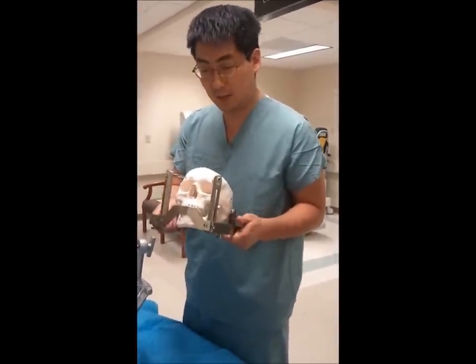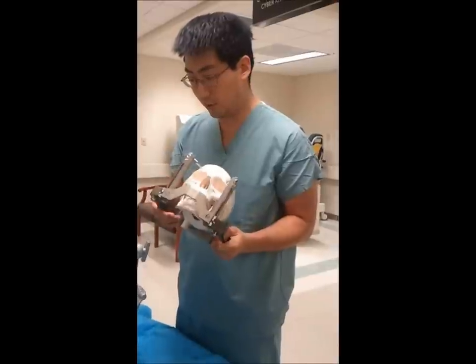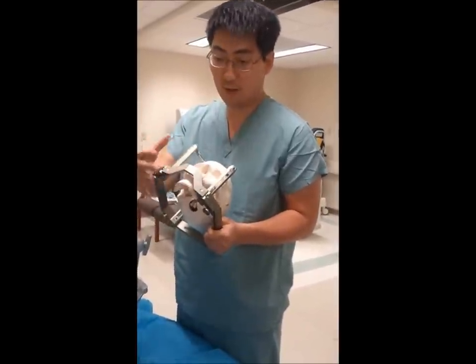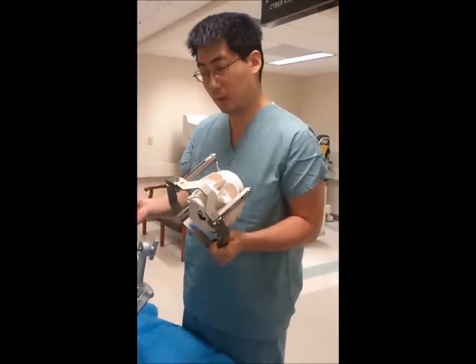The patient will have come back from MRI or CT and have had the Leksell frame fixated, and that should be nice and sturdy. The next portion is after anesthesia — once the team is happy with the sedation of the patient — make sure the patient is appropriately positioned.